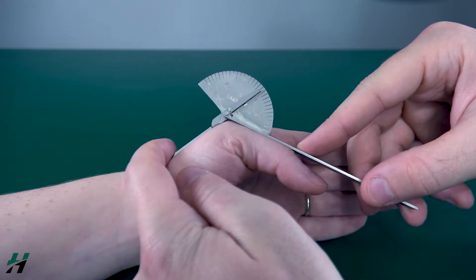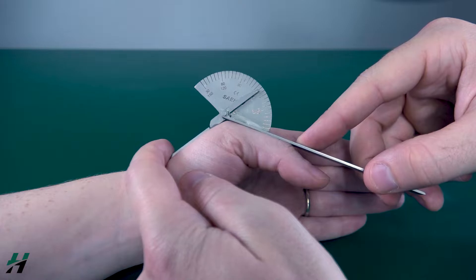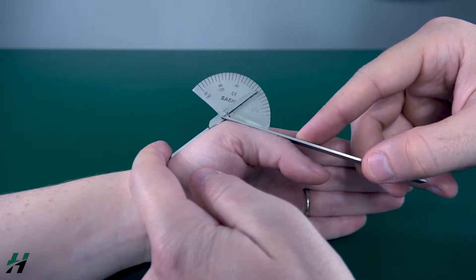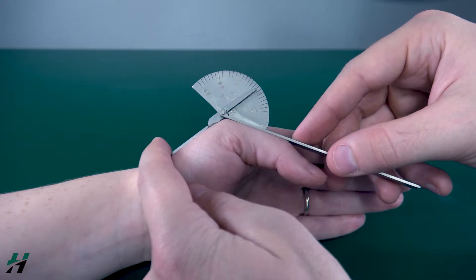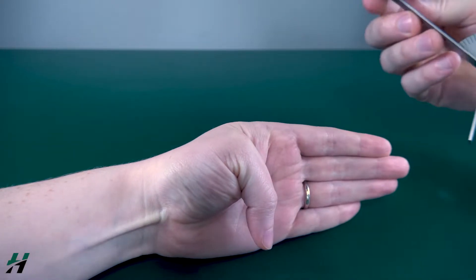We're looking at 60 degrees of flexion at this joint. That's not the normal range of motion for this joint — in most people it's about zero to 50 degrees, but Rachel has a little bit more than that. Rachel, if you could flex your thumb down as far as you can go.